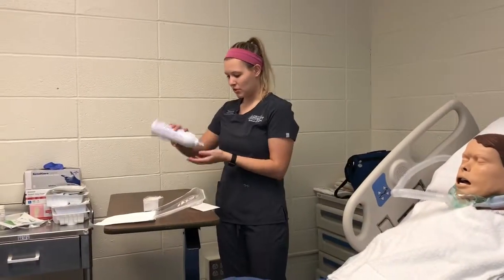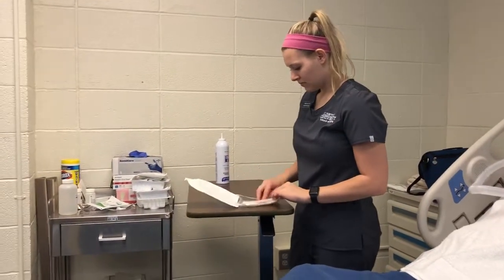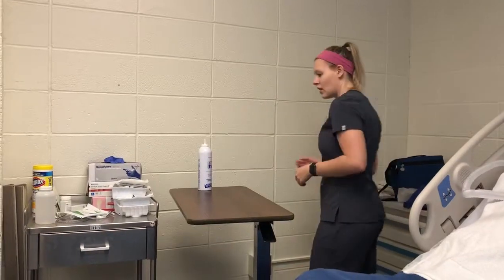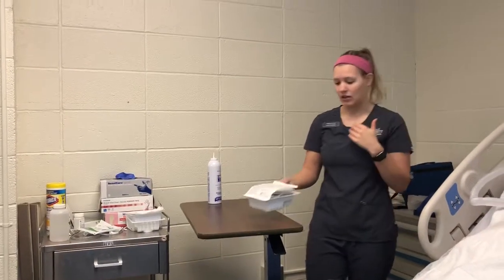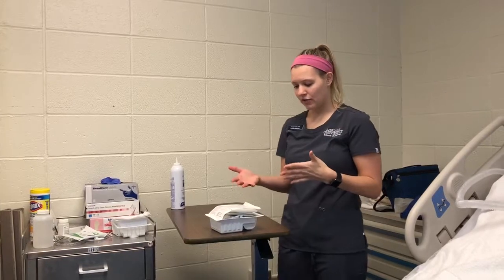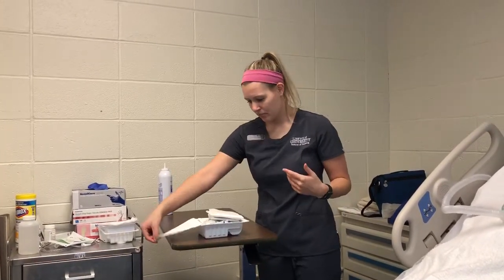So then I would wash my hands. And so my hands are washed. The next thing we're going to get ready to do is clean the inner cannula of the trach. So I have my sterile kit for doing that. I'm going to open it up.